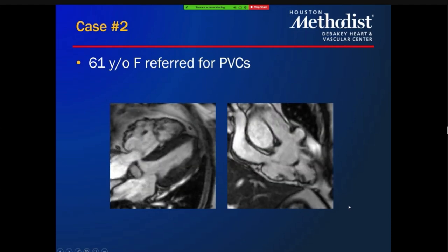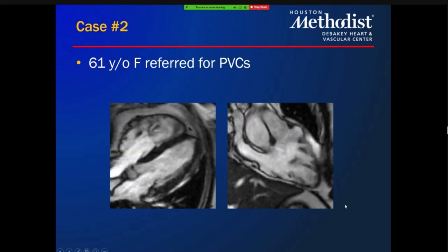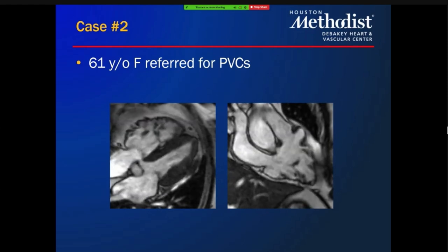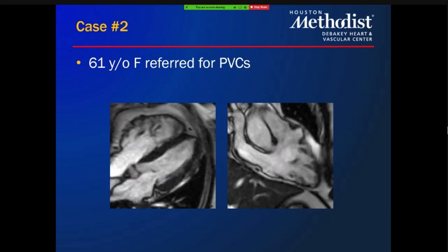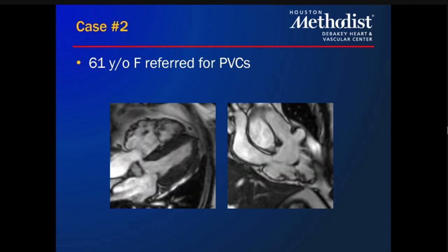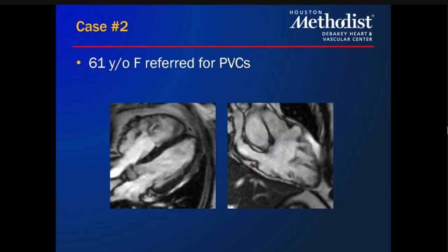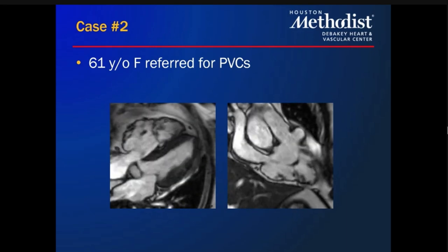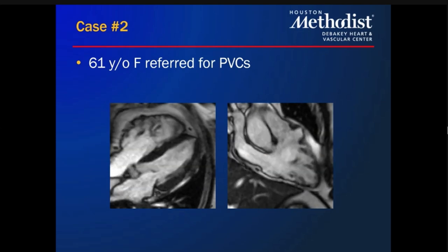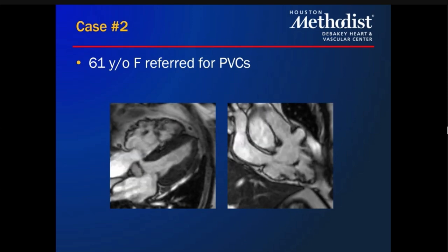I think it's actually an aneurysm because if you look in diastole, there's a displacement of the shape. There's an outpouching in diastole as well, right? Yes. But this has all the hallmarks, as Amr pointed out, of ARVC, arrhythmogenic ventricular cardiomyopathy. So much so that this patient went on to get a defibrillator and get the rest of the family screened.